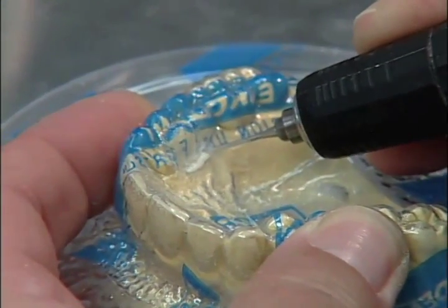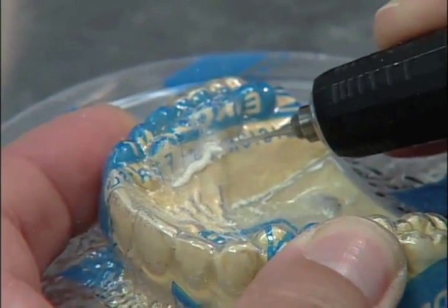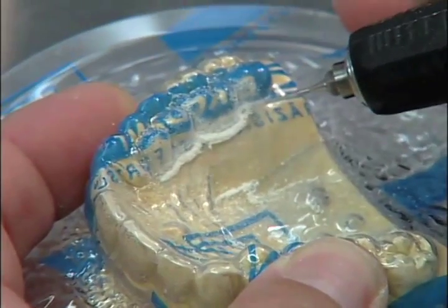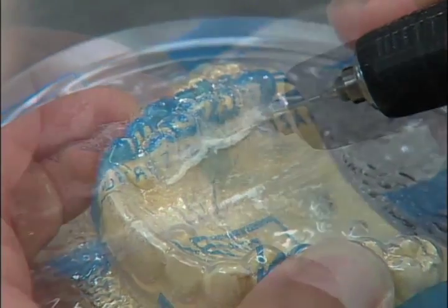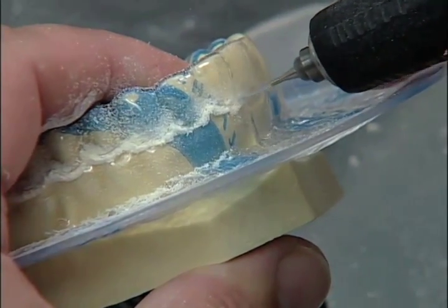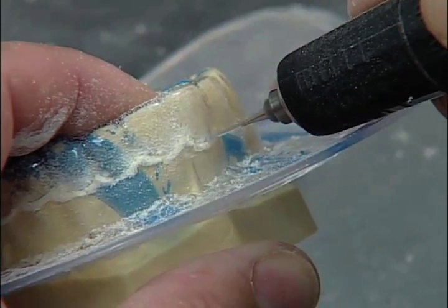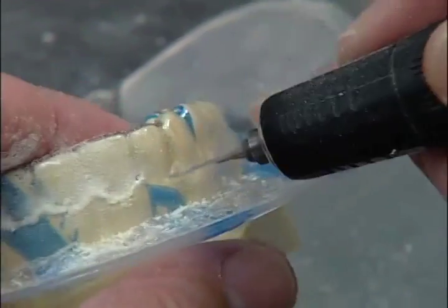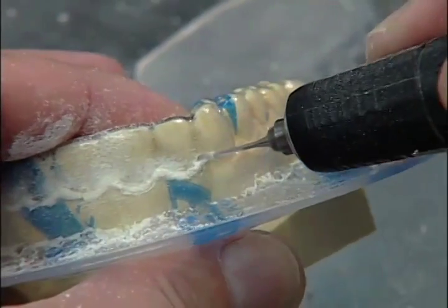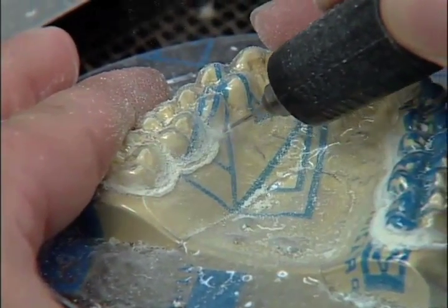Using the twist drill in a slow speed handpiece, begin cutting away the disc from the model. In the facial area, cut right at the gingival line. In the lingual area, cut just below the gingival line.